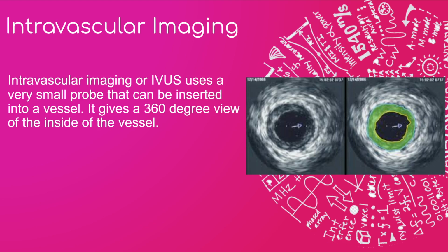So that's actually kind of cool. It can help to evaluate stenosis, as we're seeing here. We have the vessel wall. We can see the vessel wall gets a little bit smaller here. That is because there is plaque buildup. And then they can go in and measure and get a super accurate look at that.